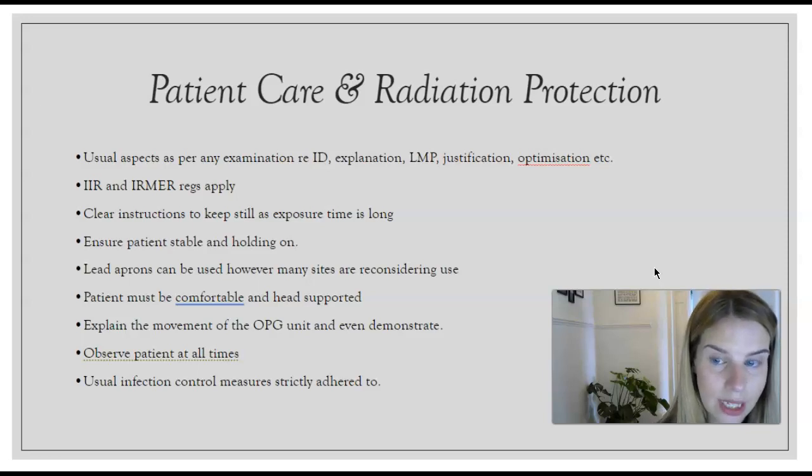because it is quite a long time to hold still, especially if someone might not be steady on their feet, or it's a child, or maybe it's someone who is not taking direction well. Just be very mindful, you're going to have to step away to expose, and they're going to have to stand and hold on and not fall over. So just keep that in mind. You don't want to walk away and then they suddenly fall or collapse or whatever it might be.